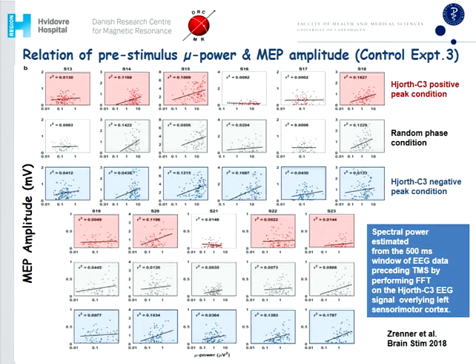Something also relevant for this paper, which has not been reported because a fixed effect analysis was negative, is that there was a clear power effect in the data. This is basically single-subject data of all subjects studied in the second part of that study, and you can see in red, which I marked a little bit, the positive slopes, showing the MEP relationship to the power. There's a consistent power effect for the trough, the blue ones. In each subject, the slope was positive. So even though it was not reported, there is also a power effect in that study.